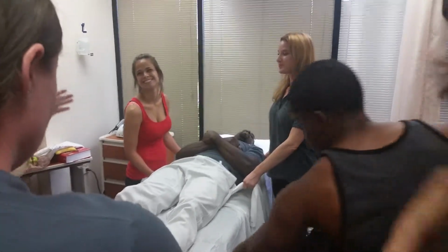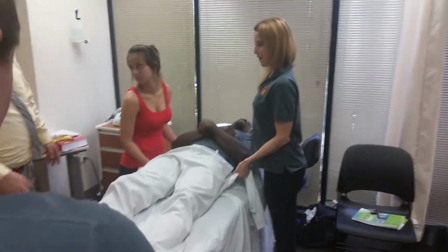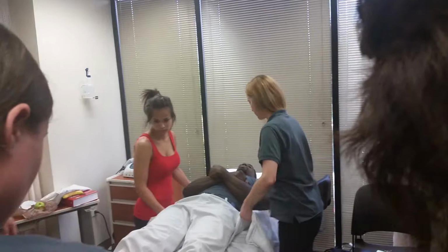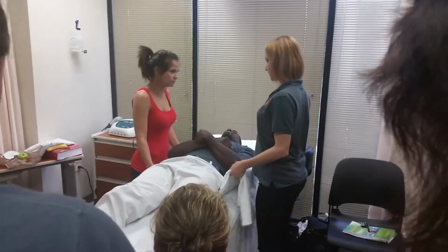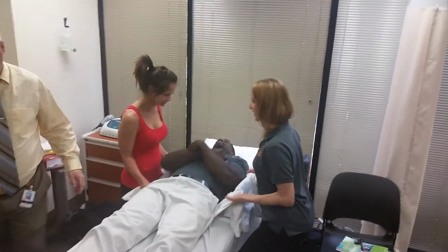Maybe the sheet at the bottom should be held, like one of you guys hold it on the other side, so the sheet doesn't walk off. That's a very good point, Mike. Watch his feet. Keep your elbows in. Okay, go ahead. Alright, ready? 1, 2.